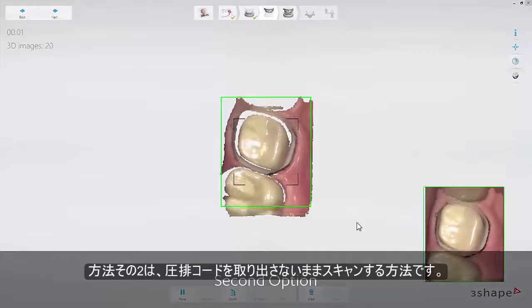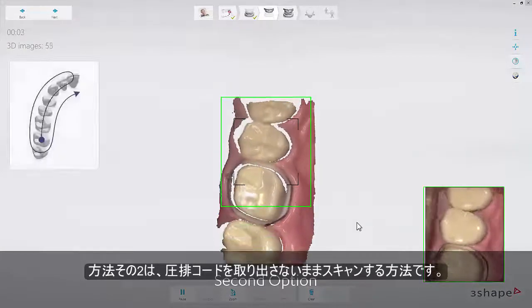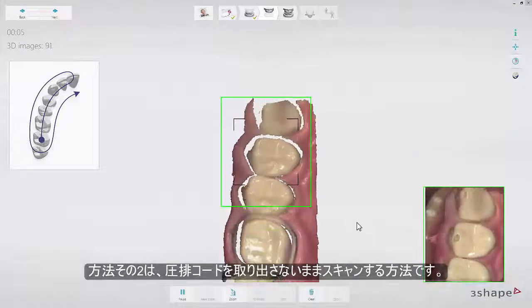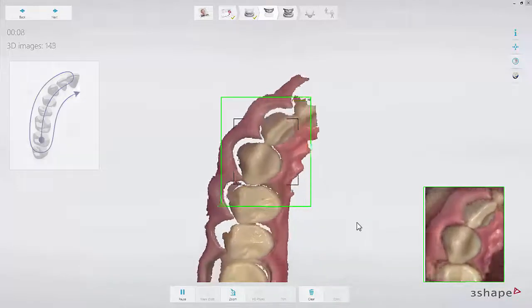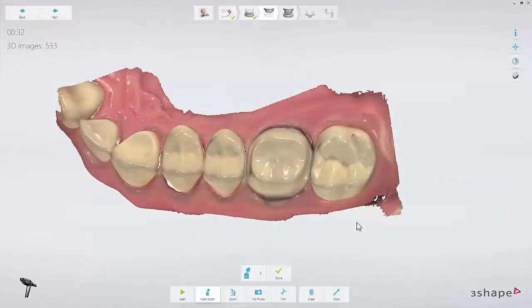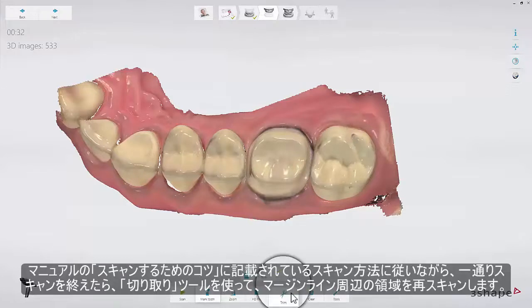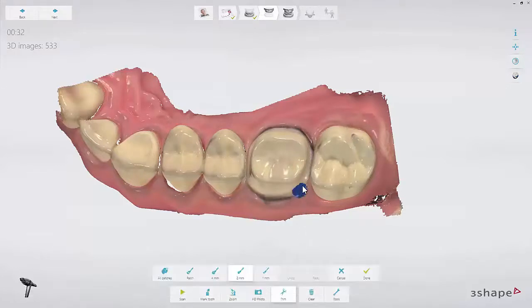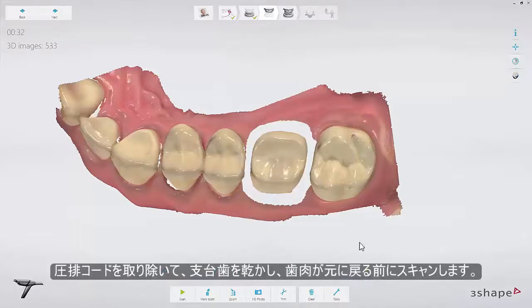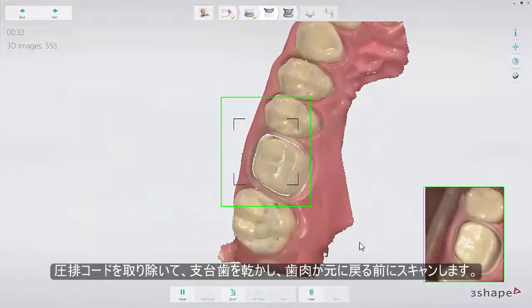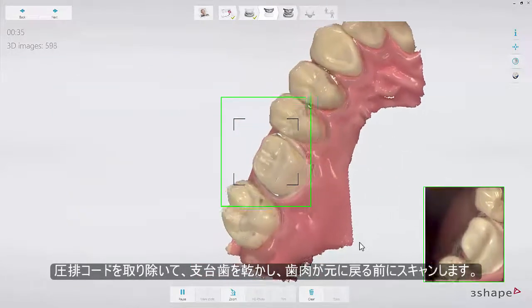The second option is to leave the retraction cord in place and scan the arch following the scan strategy. Then trim away the margin in the scan with the trim tool. Remove the retraction cord, dry the teeth, and scan the margin immediately before the gingiva collapses.